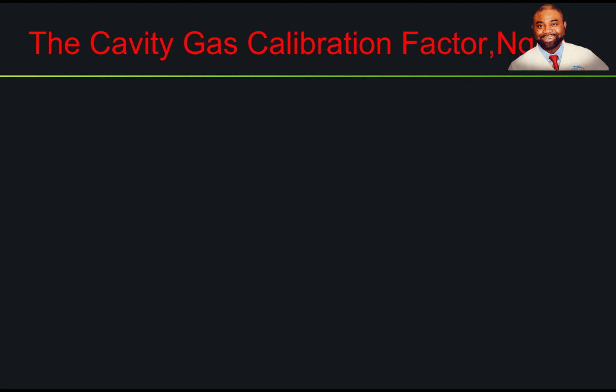In order for us to do this, we need a multiplication factor called the cavity gas calibration factor.